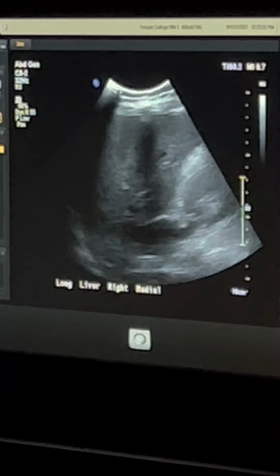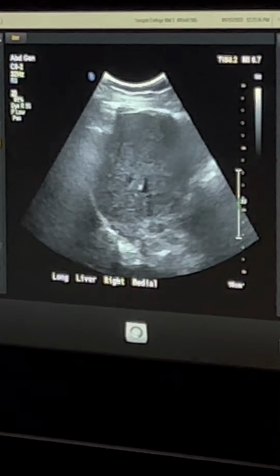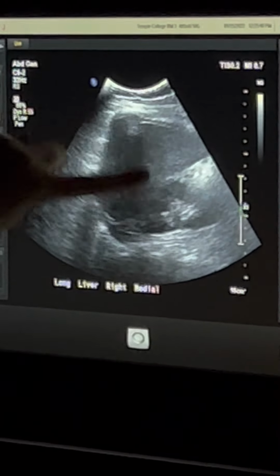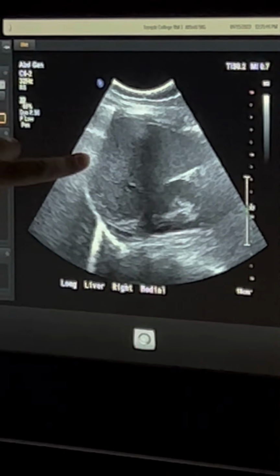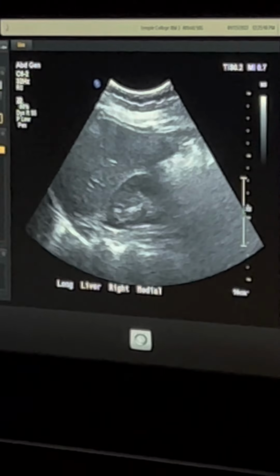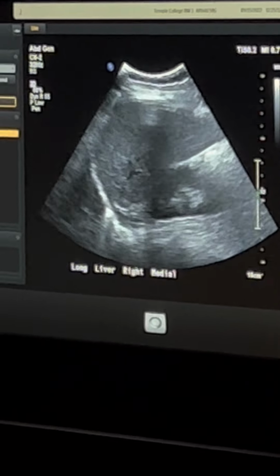Same thing here. Deep breath for me. If I wanna get intercostal lateral images, see this is her rib shadow here. I need to get around that. So I'm gonna show here, and I'm gonna show here because that was covered up with that shadow before. Okay, does that make sense to everybody?